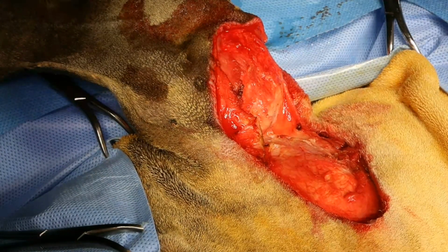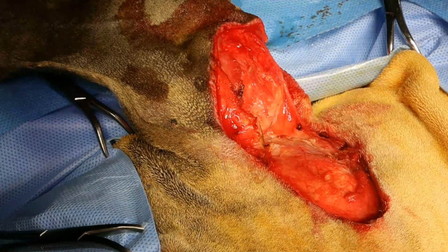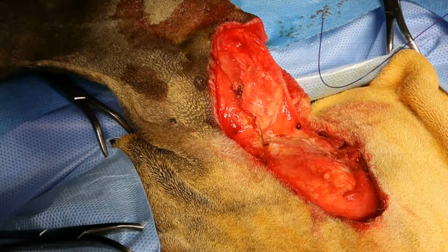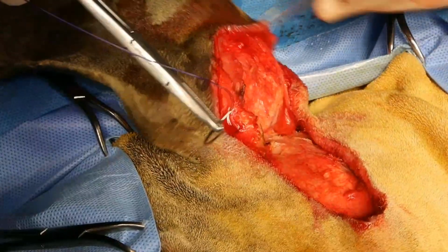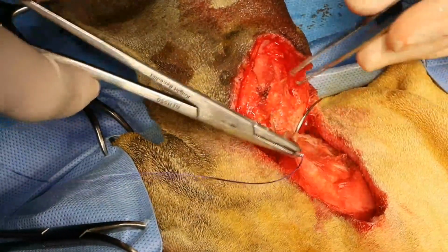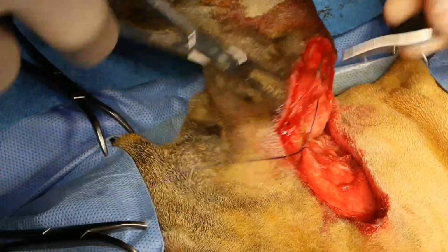I'll just use the bigger needle drivers, like this big needle, so we don't spring the needle drivers. All right, so what I'm going to do here, I think that this will come together like this, and that'll come up like this. So let me just see if I can get some deep subcutaneous sutures just to provide some support.